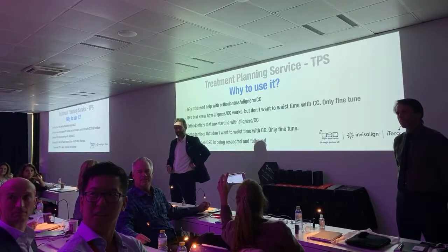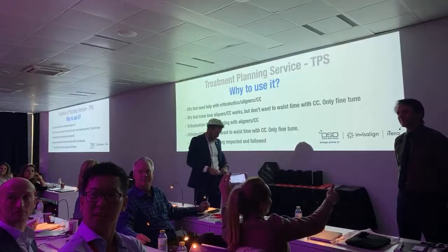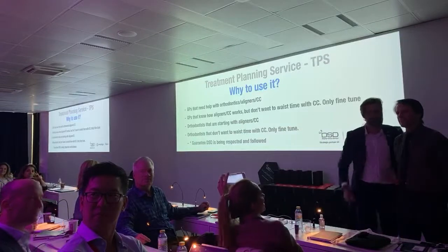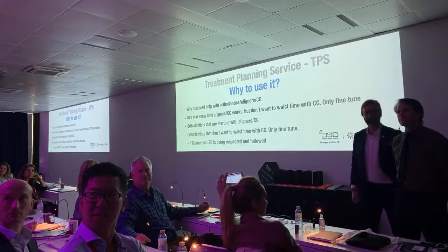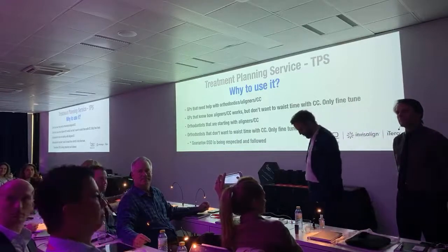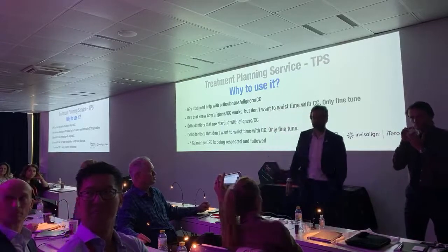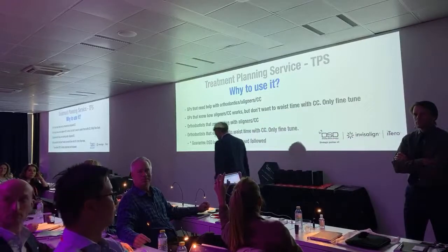What is more important is TPS, because we have to think about face, positioning, smiling, midline. ClinCheck is procedures, tooth movement. That is not analysis. TPS is a higher grade, so I use it.